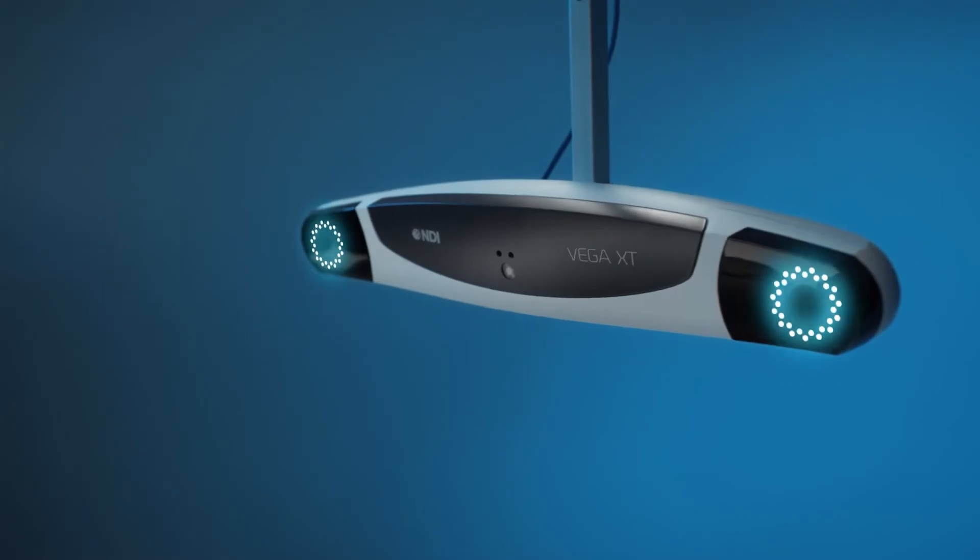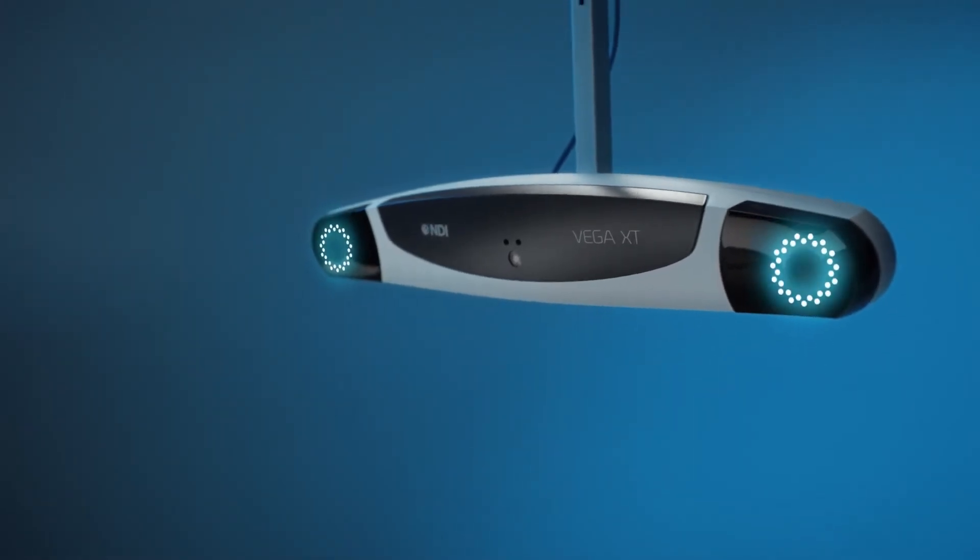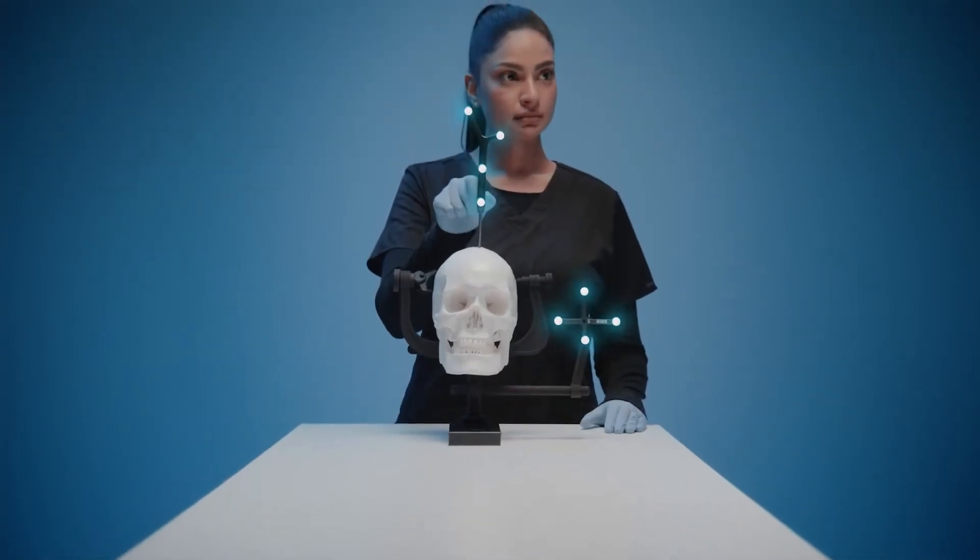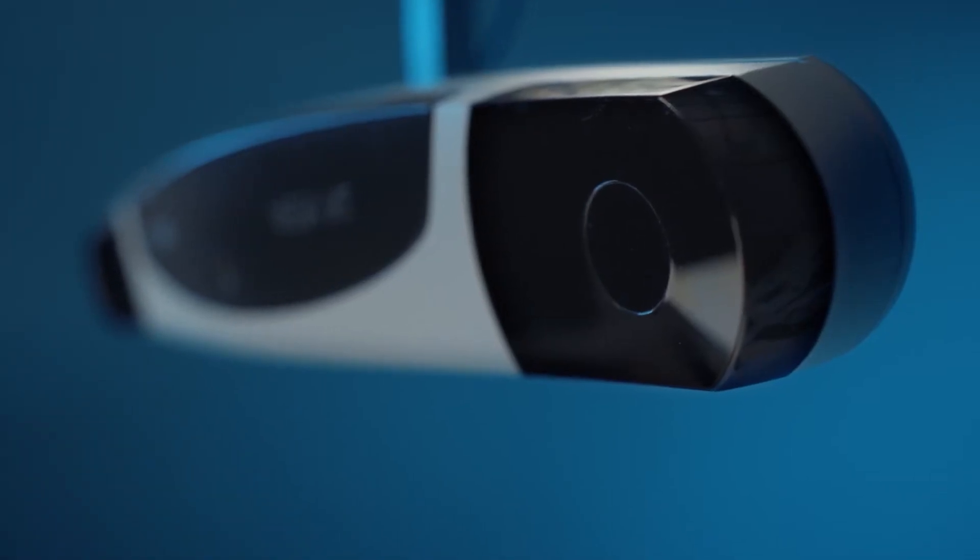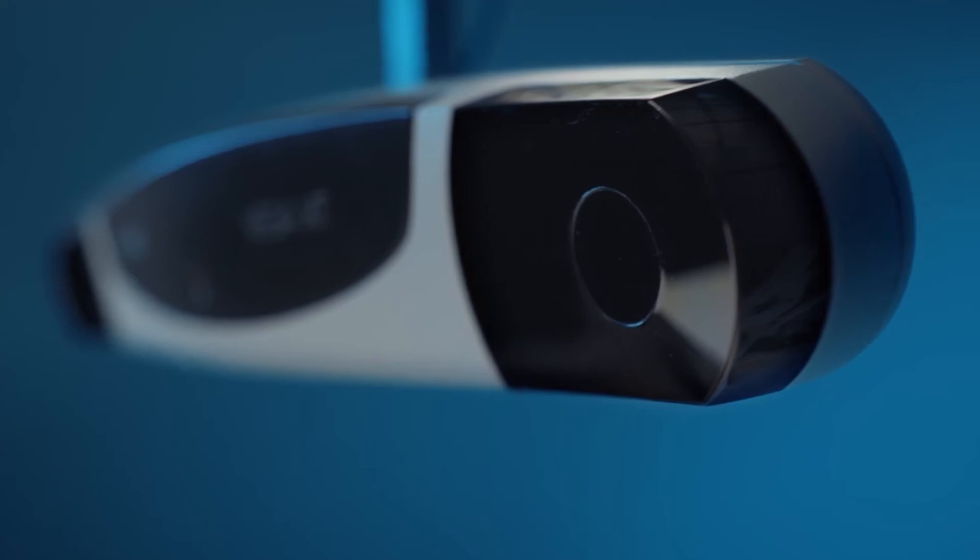A tracking unit floods the surgical site with infrared light. The marker spheres reflect the light back to sensors on the tracking unit, determining the position and location of the surgical instrument.